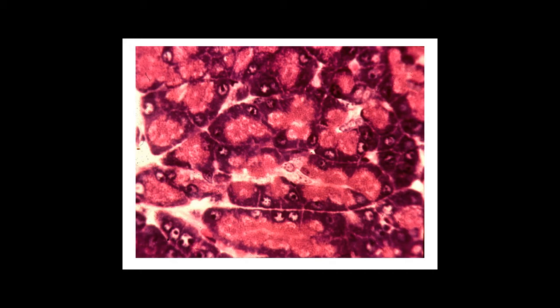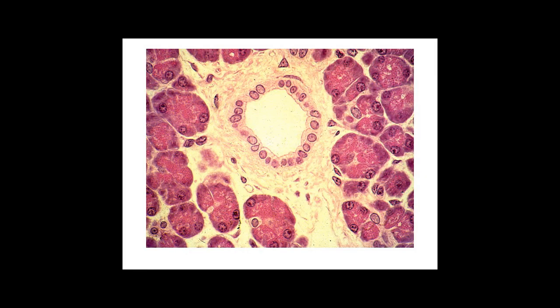This is an H&E stained image. We'll point out that the dark blue, the basal basophilia, is due to the hematoxylin staining, where the more orange stain is due to the eosin staining components of the dye. The center of the slide is a large profile of an excretory duct from the pancreas surrounded by connective tissue. So really what you're looking at is connective tissue coming right out at you in the plane of the section, with a lobule on the left side again coming down into the plane of section.